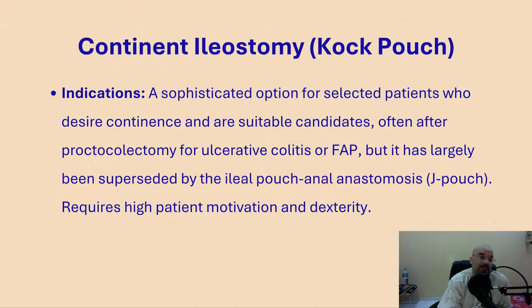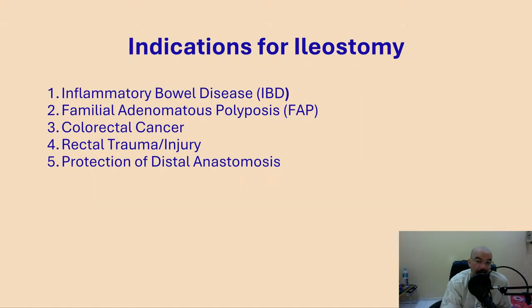This is the case where we end up with a catheter going out from the ostomy, and through this catheter we can not only take things out from the patient but also give the patient something.